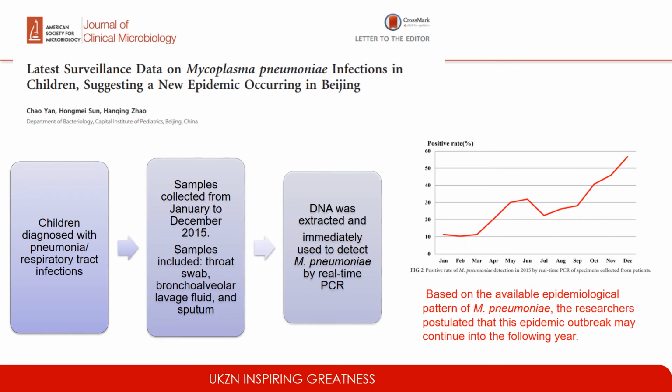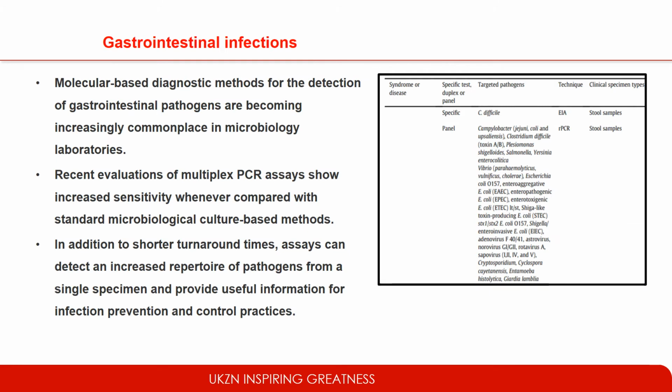So this was a nice way, using a DNA-based assay and real-time PCR, to track the spread of and the frequency of infections in that specific population. So let's go on to different pathogens such as gastrointestinal infections.